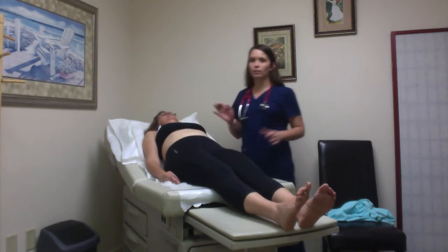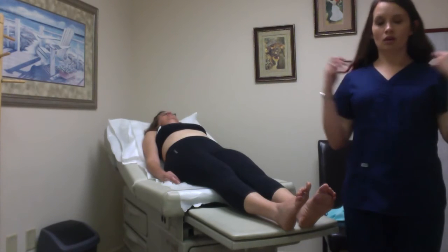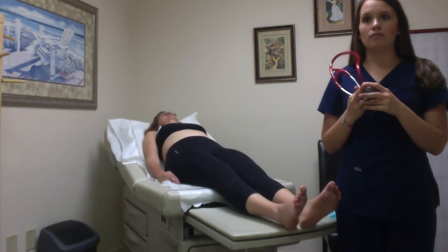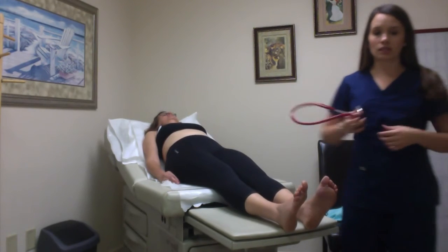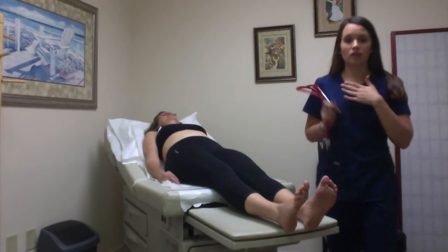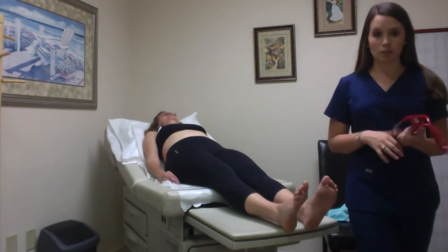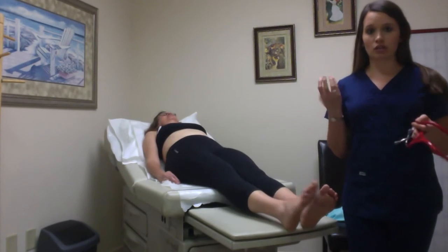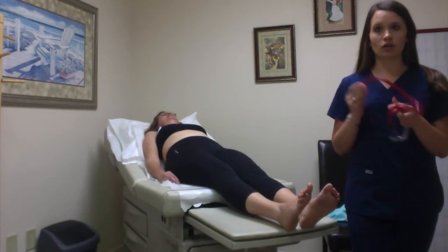So next, I'm going to auscultate all 5 precordial points, and I'm going to use both the bell of my stethoscope as well as the diaphragm. I'm going to listen while she's lying down, and then I'm going to ask her to sit up. I'm going to listen again in both of those positions. I'm just going to be noting the rate, rhythm, any extra sounds, and particularly any murmurs. And murmurs are definitely best heard with the bell of your stethoscope.